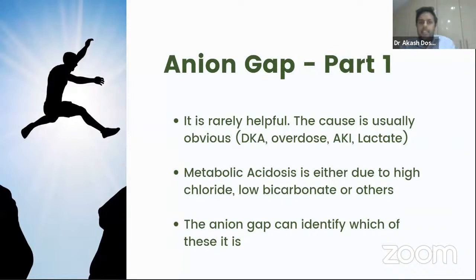Anion gap is another thing. But once again, it's rarely helpful in real life. I don't think I can think of at all a single situation where the anion gap changed my management of a patient. The cause is usually obvious.